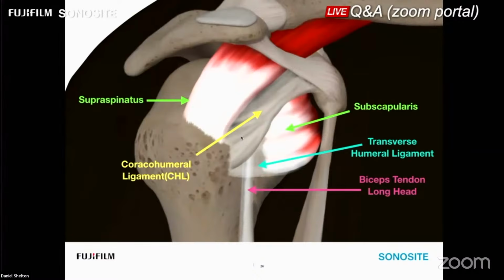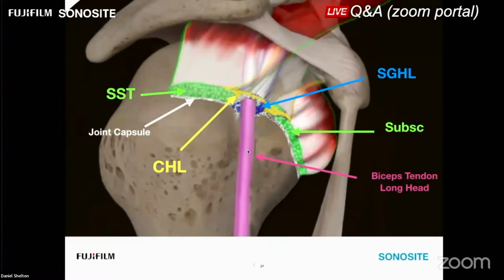So we're going to slice this and get more of a cross-sectional view of what we're looking at. We just got done evaluating the anterior supraspinatus and its cross-section. Surrounding like a yin-yang and like a hammock on each side bordering the biceps.